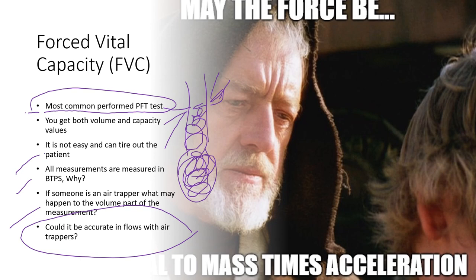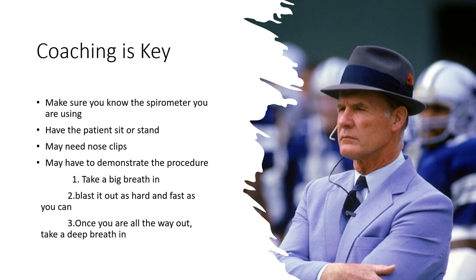Coaching is the key component to this. Make sure that you know the spirometer you're using, whether you start at TLC, whether the patient inhales to total lung capacity and then exhales to residual volume. You've got to know your spirometer and the equipment that you're using. Most of the equipment out there now is pretty intuitive, and if you don't know, you can always observe or do one on a coworker. You've got to make sure you know your equipment, when to hit record, and when to follow the prompt so that it records accurately.